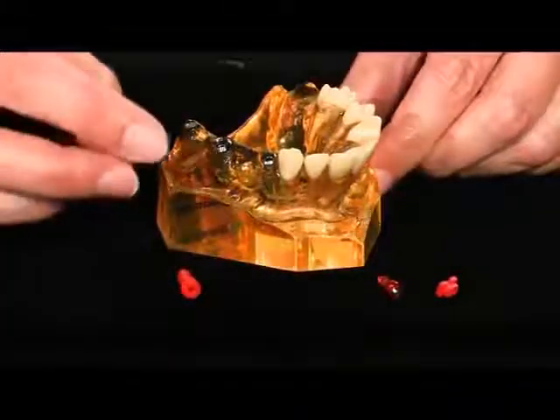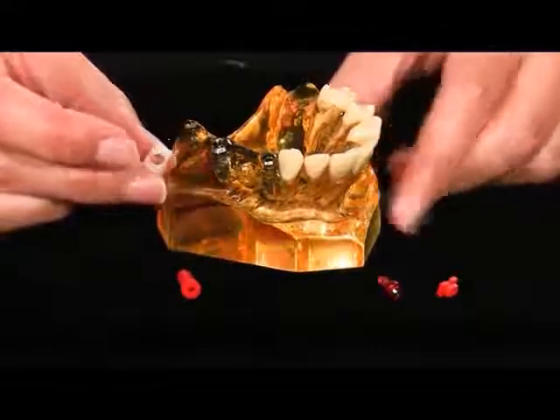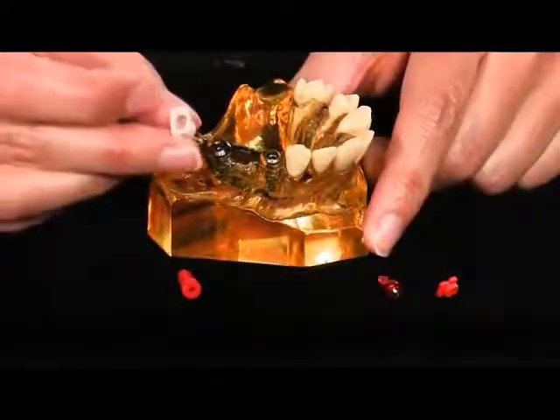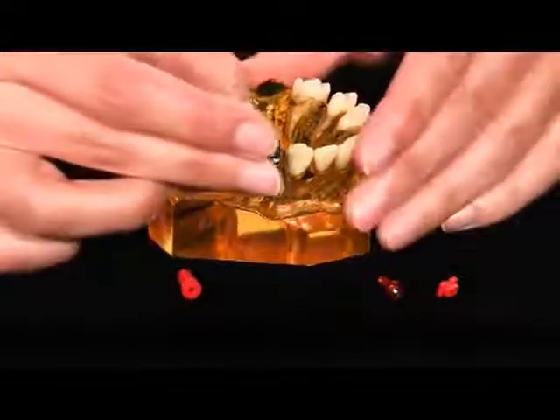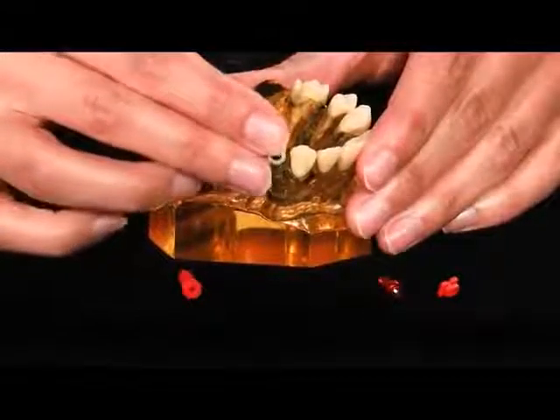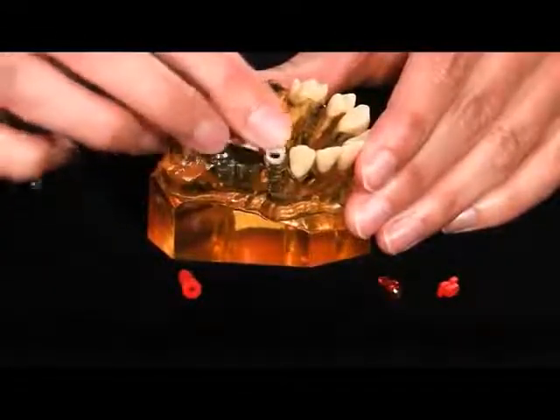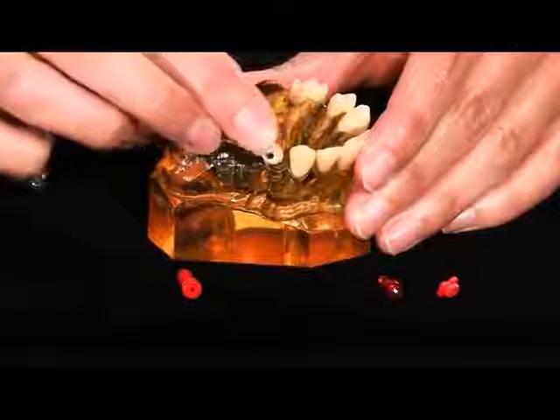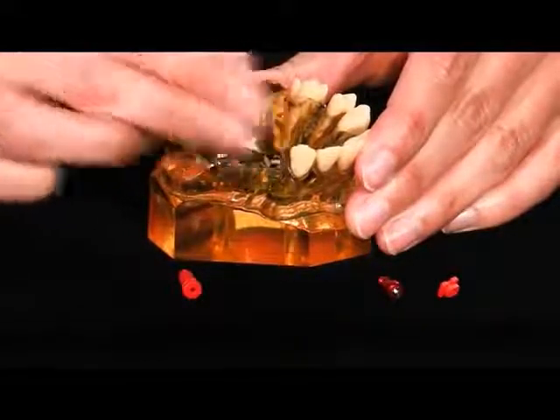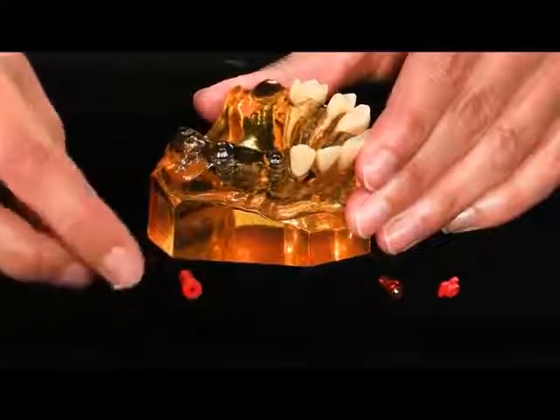We're all familiar with these snap-on tissue level closed tray components. They're only indicated for single use, but sometimes restoring doctors will try to reuse the components. When they try to reuse the components against this indication, they'll find that they're worn out, they don't usually snap into place, and they struggle to get it to seat on the implant. This is very frustrating for the patient and for the restoring doctor.